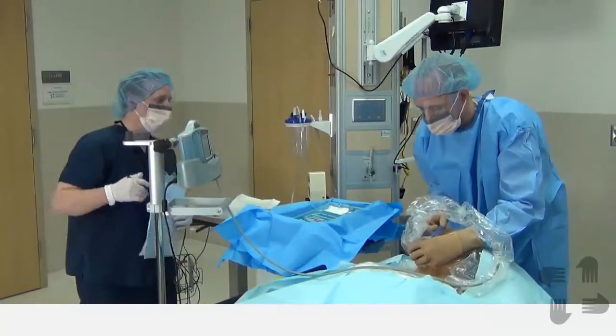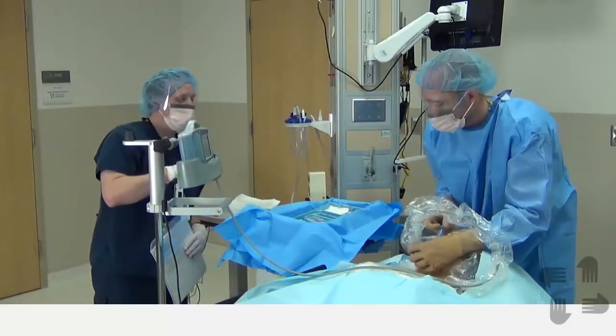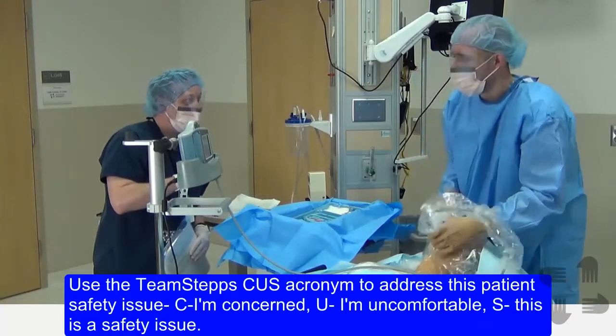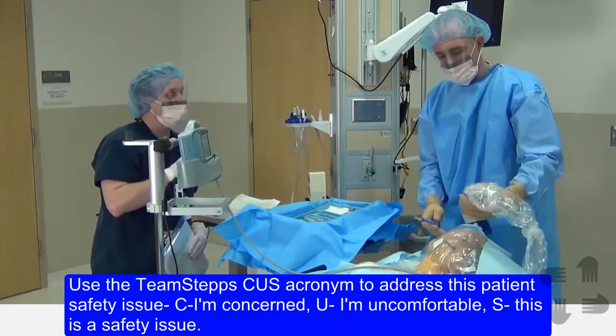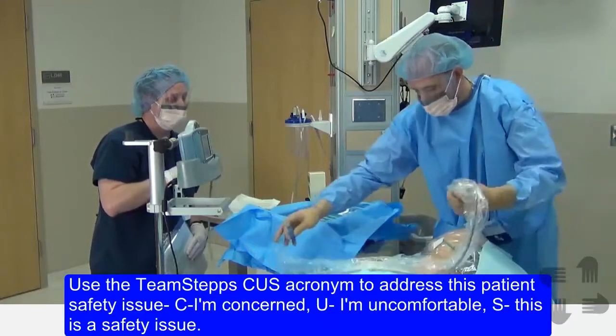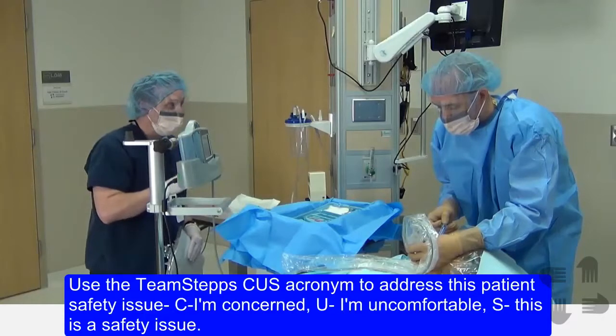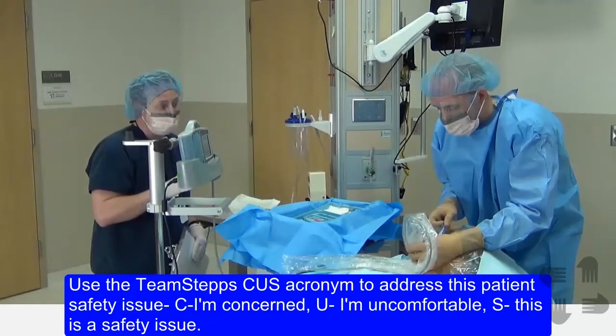Hold on one moment here. Hold on. Excuse me, Travis, I'm concerned that you just broke the sterile field and you weren't aware of it. Look, it's fine, all right? Just give me a second here. This is really challenging. Now I'm uncomfortable that you realize you broke the sterile field and you're still proceeding.